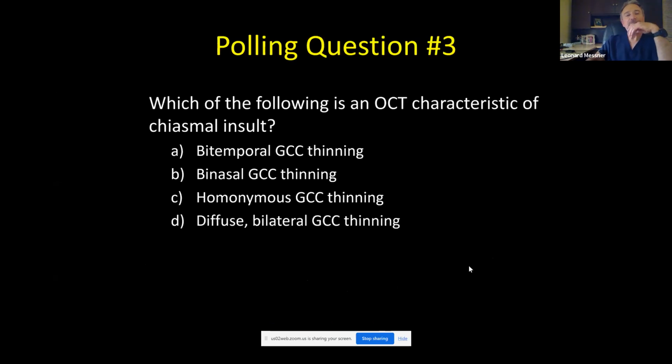All right, so polling question number 3. Greg, are we ready for this? You want me to read it? Yep, it's up and it's launched. All right, great. So which of the following is an OCT characteristic of chiasmal insult? A, bitemporal ganglion cell complex thinning. B, binasal ganglion cell complex thinning. C, homonymous ganglion cell complex thinning. Or D, diffuse bilateral ganglion cell complex thinning.